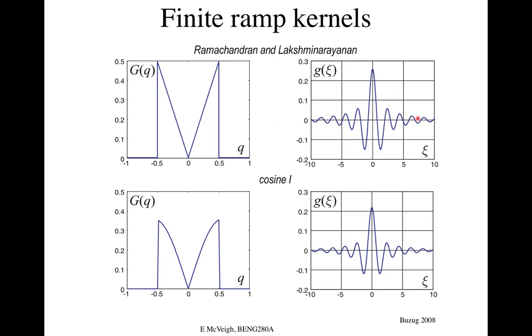So here is what the Fourier transform of this thing looks like. We looked at modifications of this briefly last time. One way of smoothing things out a little bit is to roll it off here, so that perhaps this is a cosine function instead of just a ramp, and when you hit the peak of the cosine, at least your derivative is zero. You're not pointing into space and then just shutting it off, so that your first derivative just shuts down to zero. So that's a simple ramp.